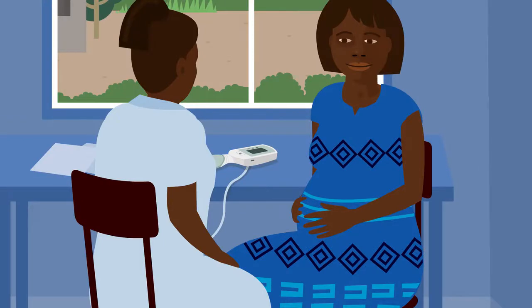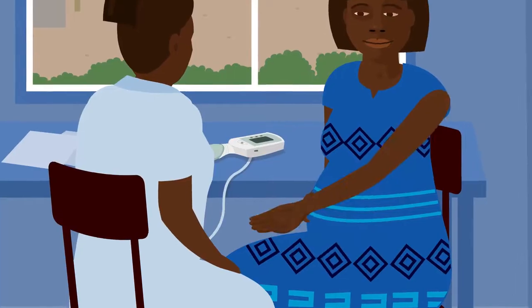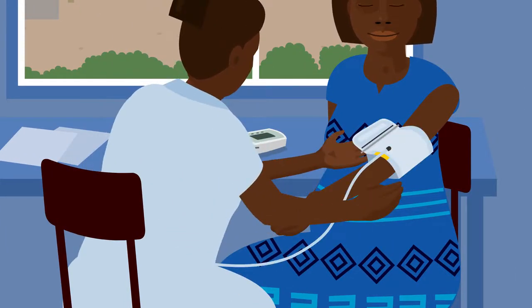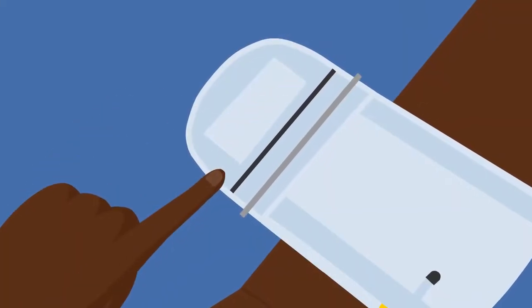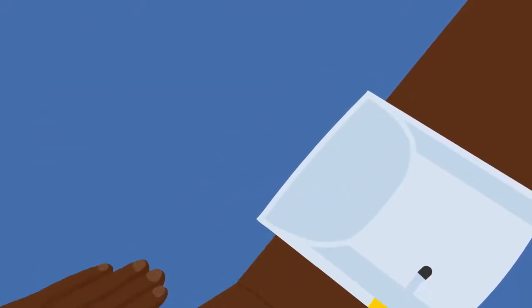Remove clothing from her upper arm and rest her arm on a stable surface. There are two cuff sizes; the standard size will fit most women. Put it on and slide it into place. As you tighten the cuff, the metal bar should pass over the black marker. If it does not, the cuff is too small — use the large cuff.